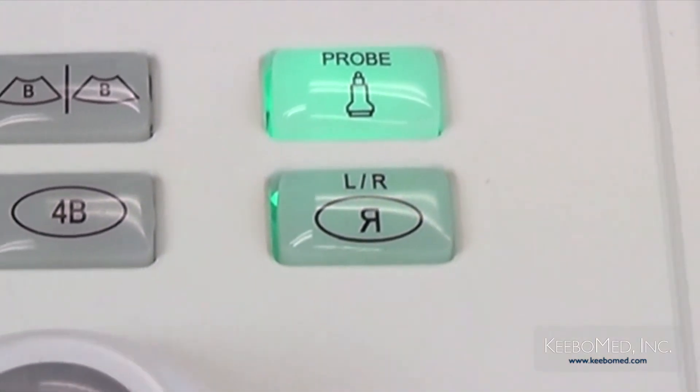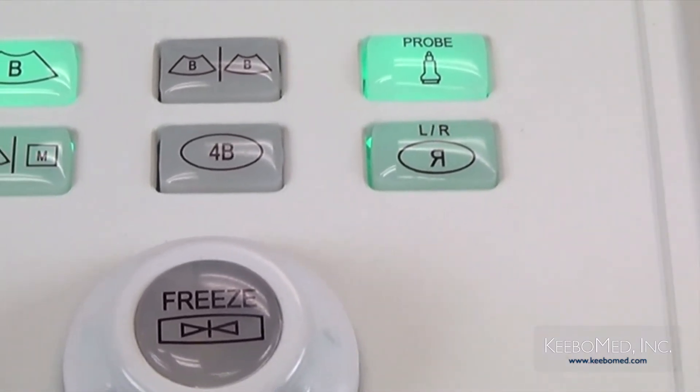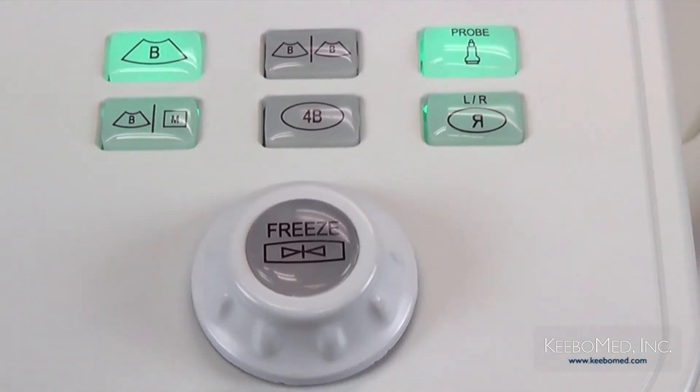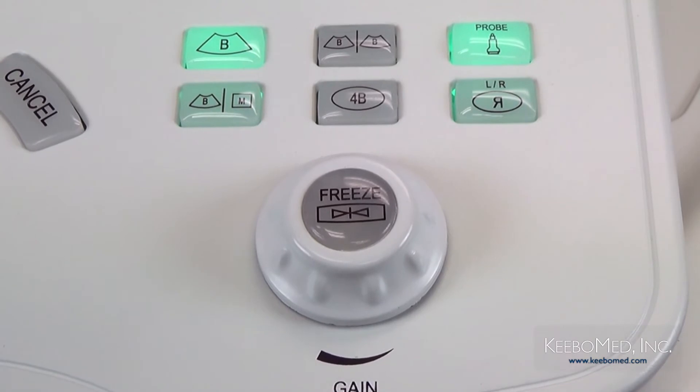Below these keys is another multi-function control knob. When rotating it in real-time status, it adjusts the total gain of the image. By pressing down on this knob, it will freeze or unfreeze the image.